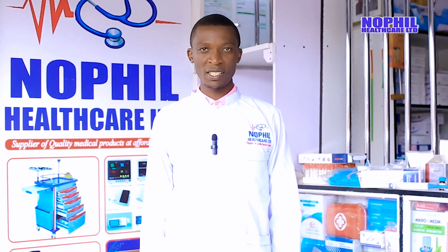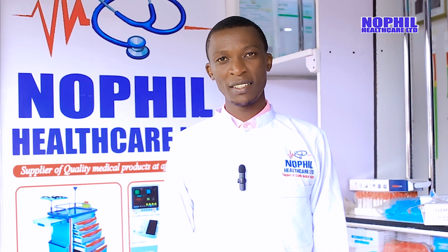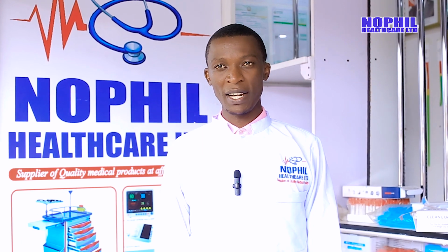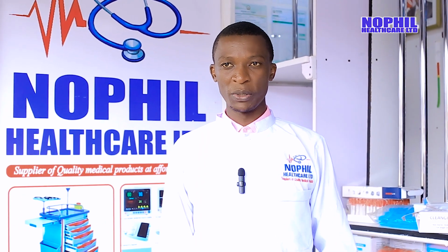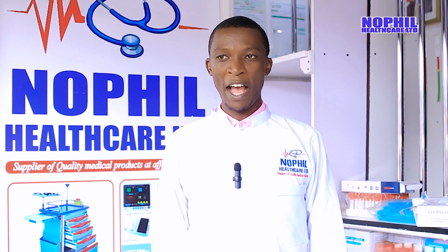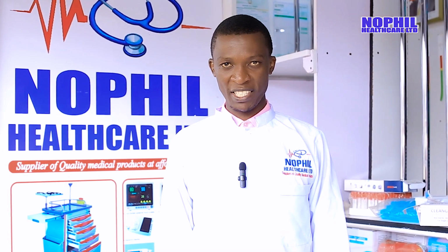As well, it is used basically to calculate the electrolytes, that is EUCs, in order to determine the condition of the patient, whereby the results that are obtained from this machine are used for clinical purposes to determine the functionality of the liver, the kidney, as well as the lipid profile within the body. At the end of the results, it will result in better and accurate diagnosis. Afterward, better diagnosis and proper treatment to the patient.